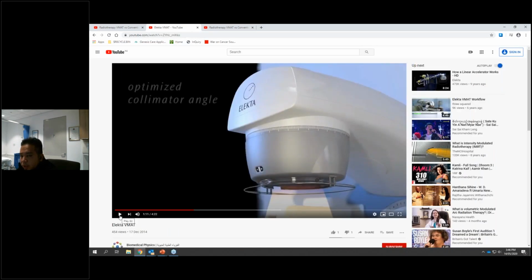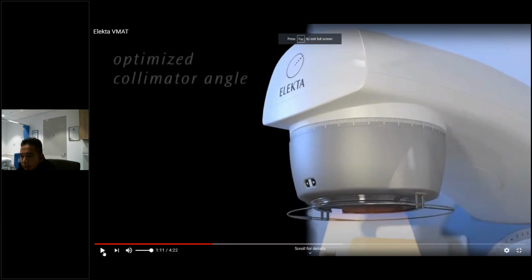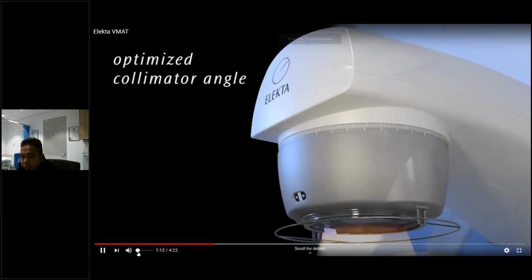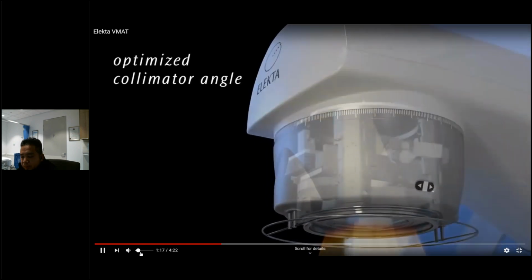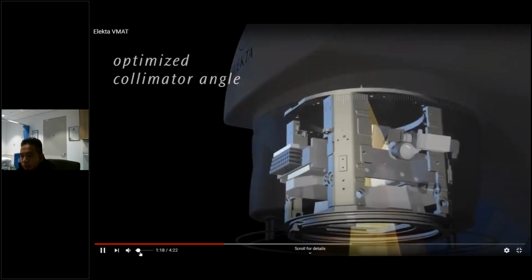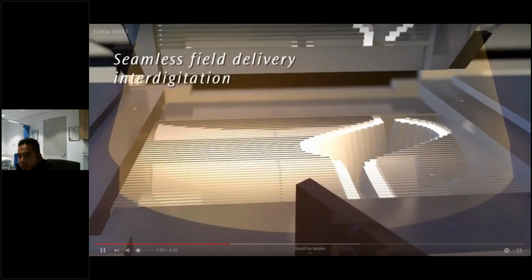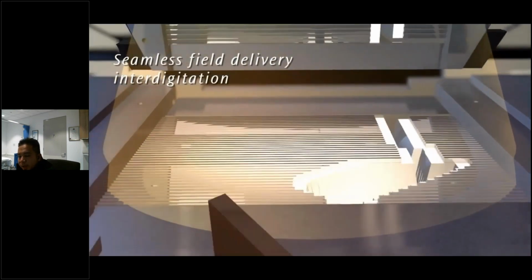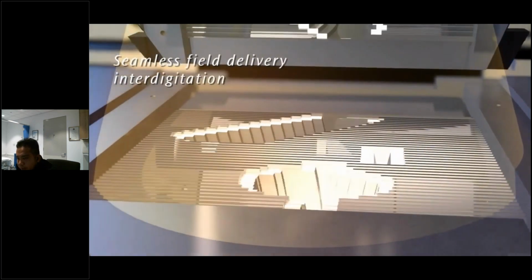And just another view here, just to show you how we achieve that. Just a quick video again. I'm just going to make that a little bit lower in terms of the sound. So in this machine now, we have multi-leaf collimators. These are the parts of the machine responsible for shaping the radiation field.